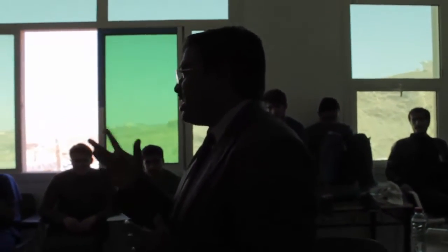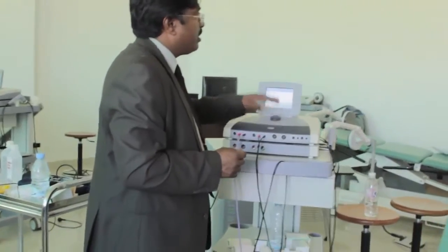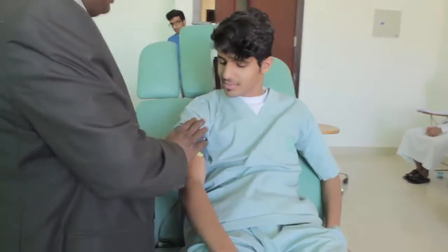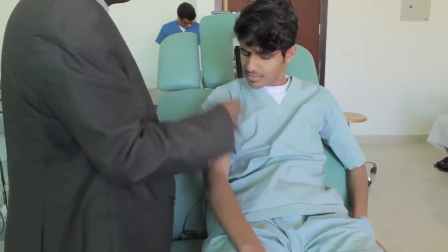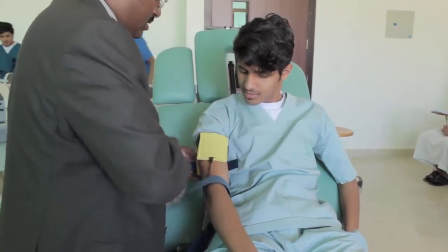So when you use Russian current, I will show you the contraction. This is only for pain and inflammation, so you cannot see the muscle contraction. Okay. Now I will show you different positions for different conditions. The electrode positions. For example, now this is for bicipital tendinitis.